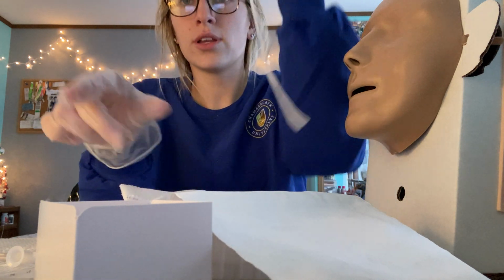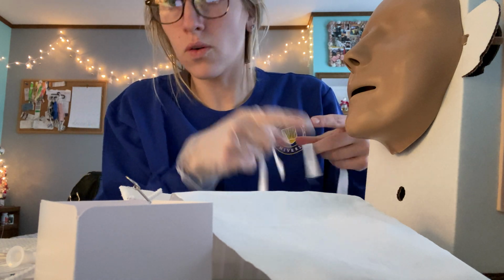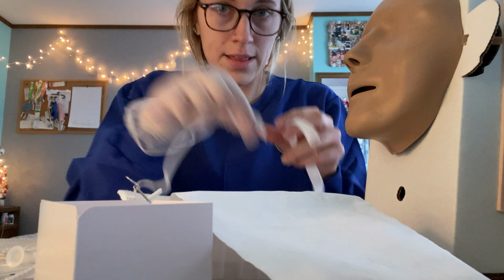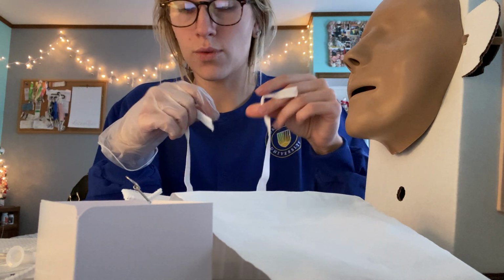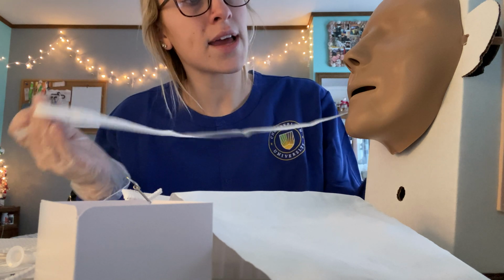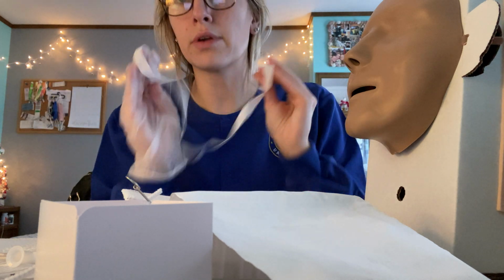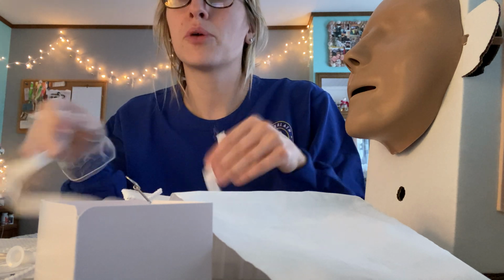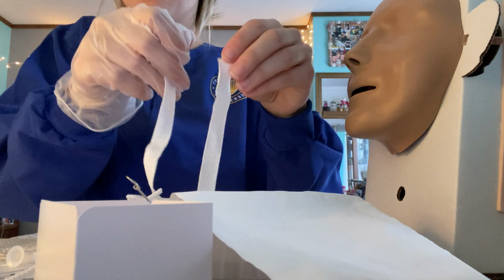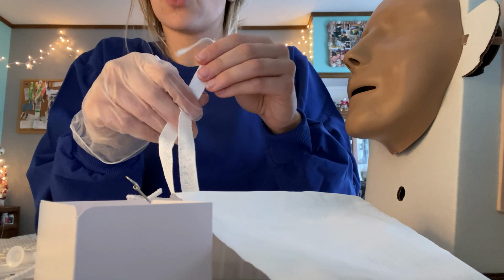ties. So when you do the ties, you're supposed to make sure that you keep the old ties on, and then you'll tie the new side on and wrap it around, and then tie the other new side on, and then take off the old one. But I don't have anything to tie this on, so then you would use the normal tie. But I want to make sure that you don't take off the old tie before you put the new one on. You keep the old tie on, put the new one on, and then take the old tie off when you're changing the tracheostomy ties, to make sure it's stable and you don't want the tube to come out and so forth.